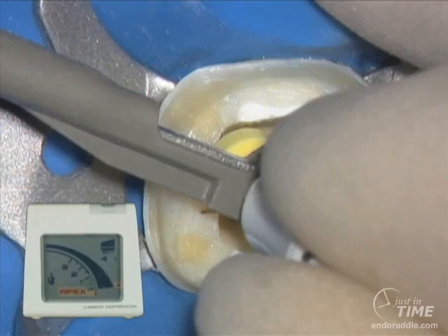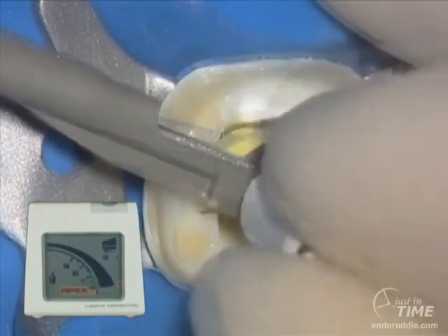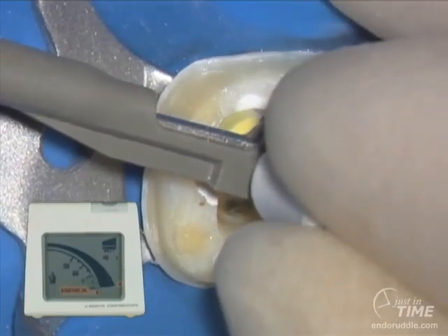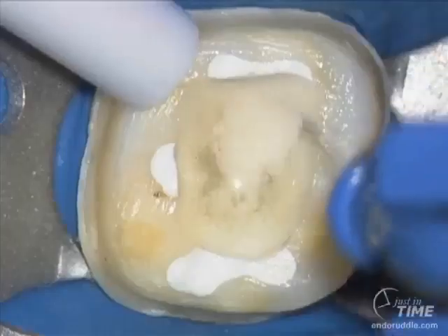Now, how do you know if the apex locator is telling you the truth? It's important to move the file back about a stop, and again the stop is about 1 millimeter. If we were to move the stop back about 1 millimeter, you would expect the digital readout on your apex locator to move back about 1 millimeter. Basically what I'm saying is, when the fingers move the file back about a stop, your digital readout should move back about 1 millimeter. Pretty much the readout should simulate exactly what your fingers are doing.